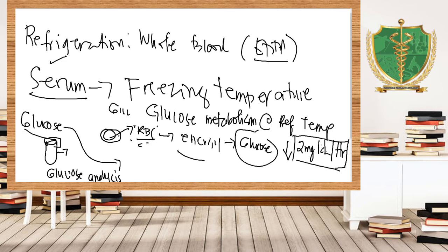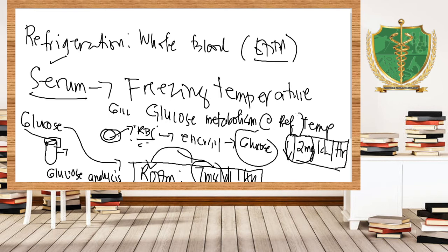So nababa siya. Kapag naman nasa room temperature lang siya, no, pag nasa room temperature, 7 mg per deciliter per hour. Ano po yung palatandaan dito? Mayaman ka. At dahil mayaman ka, meron kang 7 na room. At bawat room mo, merong dalawang ref. Okay? Take note.